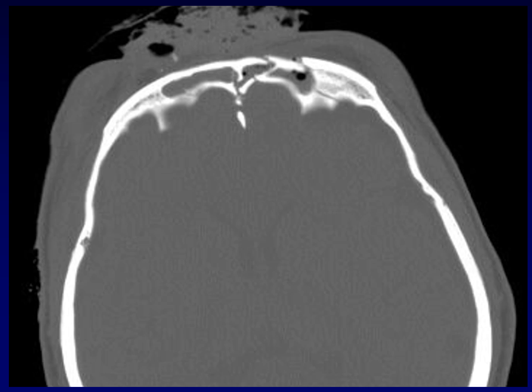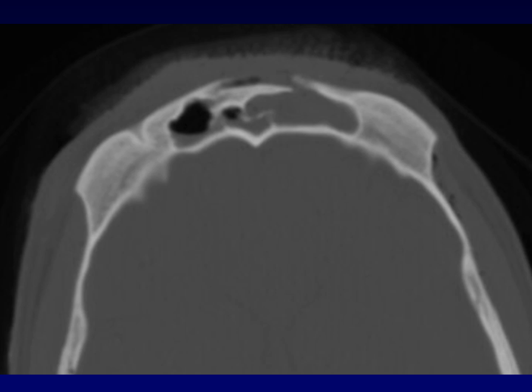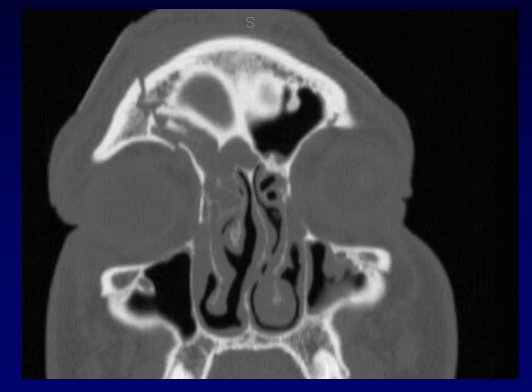The fracture line extends through the intersinus septum, and there are comminuted components of all of these fractures. Here's an example where the posterior table is intact, but there is a displaced anterior table fragment that is posteriorly displaced, and you can see how this has disrupted the intersinus septum. Remember that frontal sinus fractures may extend into surrounding structures — you can see where the fracture plane through the roof of the frontal sinus continues down into the orbital roof.